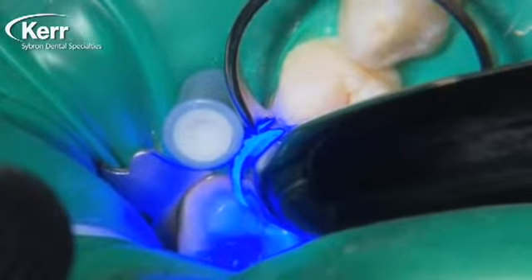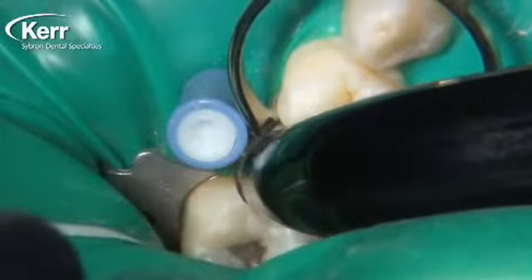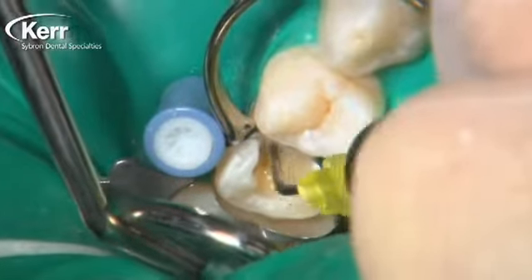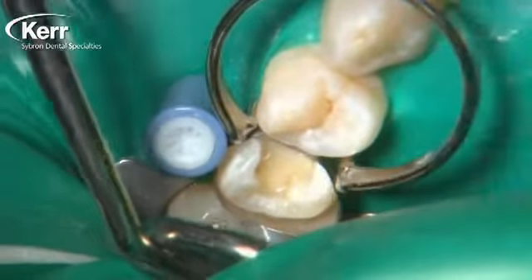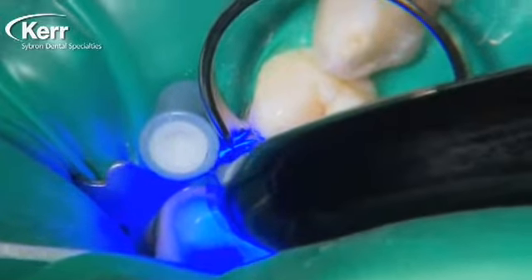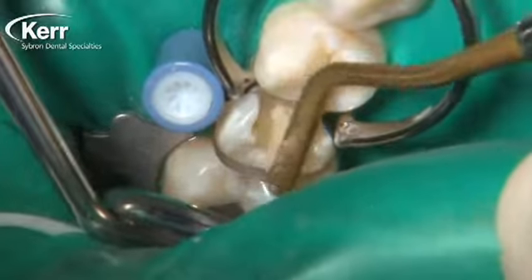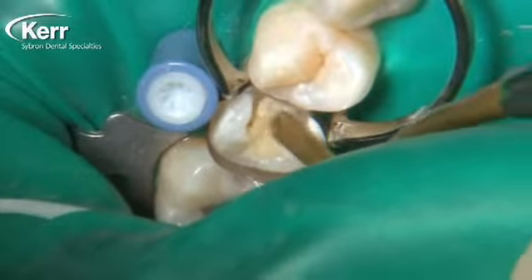Then we go ahead and light cure this for 20 seconds. This happens to be a shade A2, so a 20-second cure is more than enough. Because of the size of the hole from the decay, I'm going to place a second layer on top of that first layer. We don't need to agitate it with the brush since Vertice Flow is already covering all of the tooth structure inside the cavity preparation. We just place a little more Vertice Flow and cure it again for 20 seconds. At this point, the Vertice Flow is covering the entire tooth structure, bonded into place.